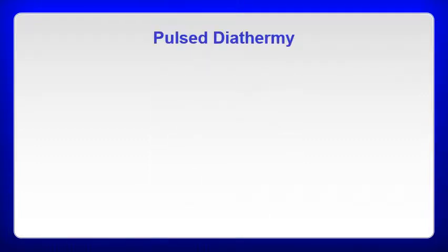Now, just to keep it simple, I'm just going to refer to diathermy again. Most of your newer diathermy units are strictly pulse diathermy. You will get some inductance machines that are continuous diathermy, but most of them are pulsed. And again, the difference here is that, unlike with pulsed ultrasound, where you're not looking to get a thermal effect, you will look to get one here.